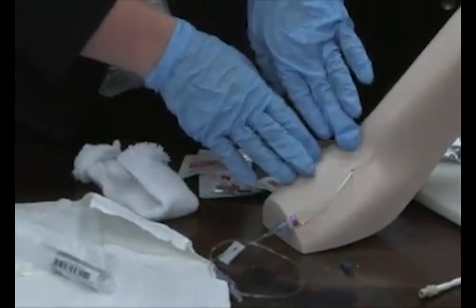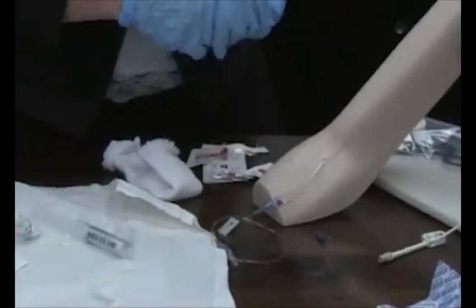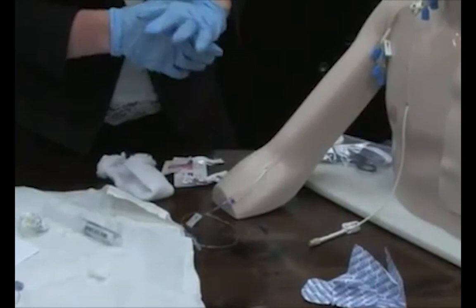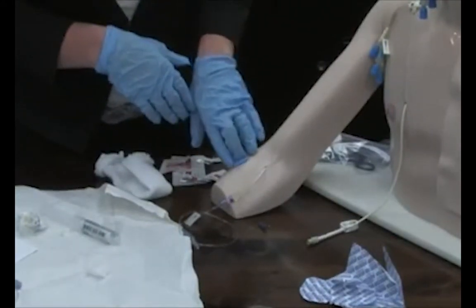Only a nurse does a dressing change on a PICC line or a midline or a line such as this. Sometimes when it's tunneled, can be taught. So just make sure that you know your policies and procedures on that. But a PICC line is always a nurse.